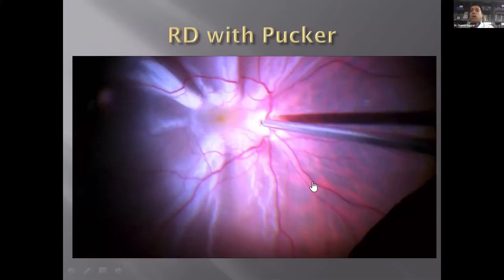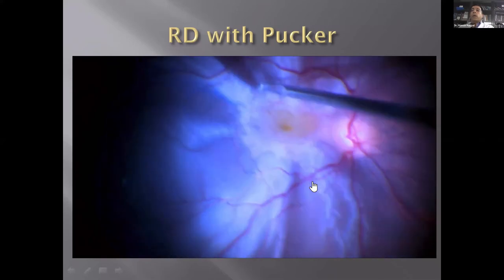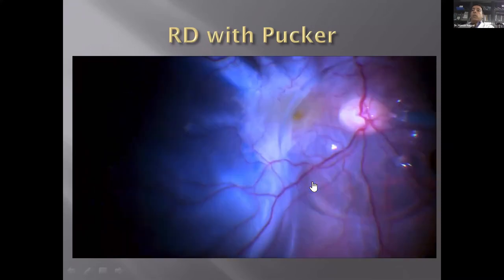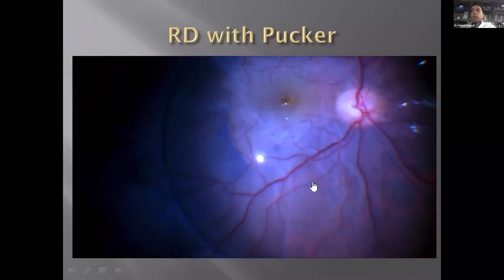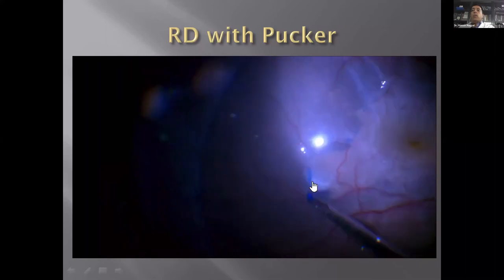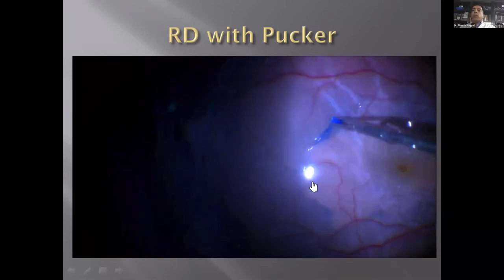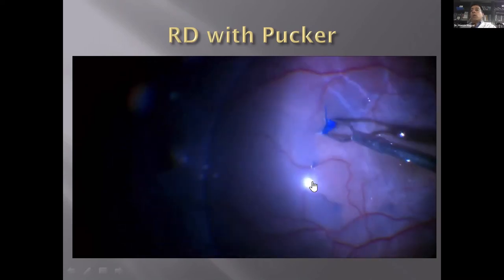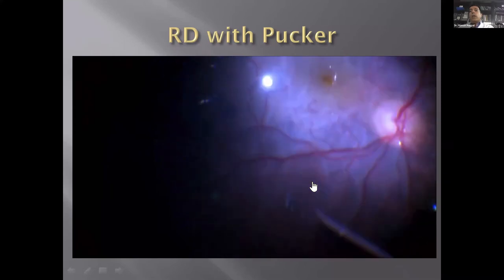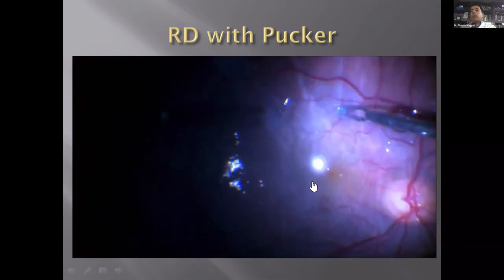This is another similar case showing striae after pucker removal — we stain and remove the ILM from that area. There is some difficulty here, so I put PFCL. An important tip: always peel away from the disc, because the disc is where the retina gets attached and it keeps the retina intact while you peel. If you pull toward the disc, you pull the whole detached retina with you. PFCL helps support while peeling away from the disc, which makes this whole process easier.